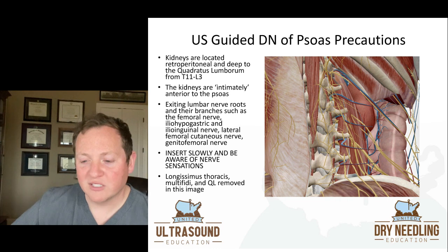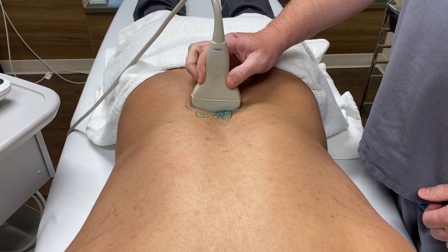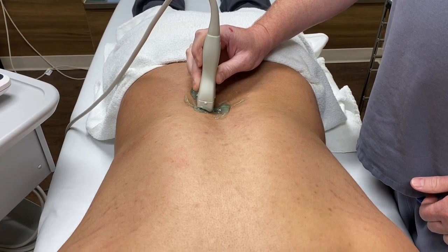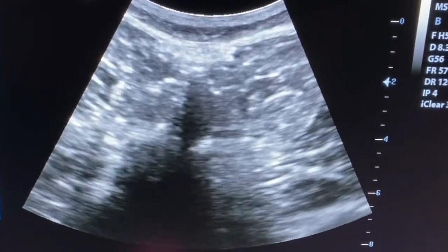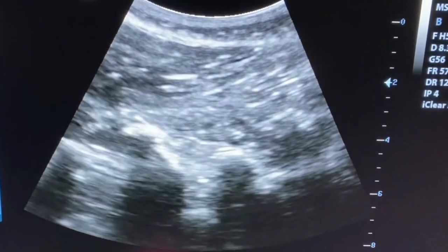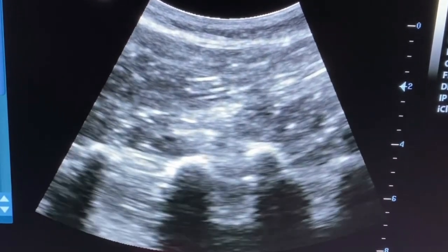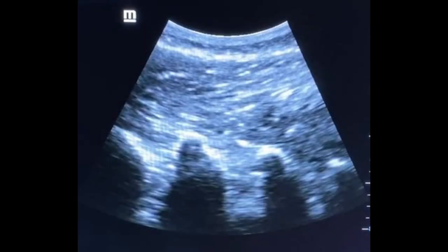In this image, the longissimus thoracis, latissimus, and quadratus lumborum are removed. For transducer positioning, we'll start in the short axis with a transducer on top of a spinous process, then move into the paravertebral gutter and rotate the ultrasound transducer into the longitudinal axis. In the live ultrasound view, the first black spot you see is the spinous process. As I rotate into the long axis, you'll see three little knots at the bottom of the screen — they look like three little knuckles — those are the transverse processes. The psoas lives deep to the multifidi, in between those transverse processes.